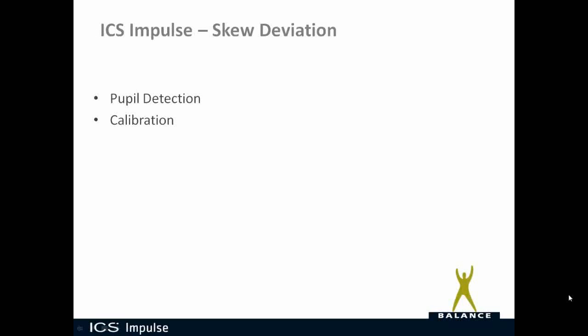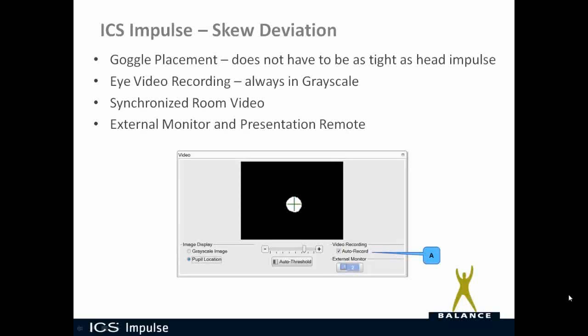Regarding pupil detection and calibration, those two topics are covered in separate videos. For goggle placement, the goggle does not have to be as tight as for head impulse. It needs to be tight enough so that it stays in place, but if you're not moving the head, it does not need to be as tight as it does for head impulse.